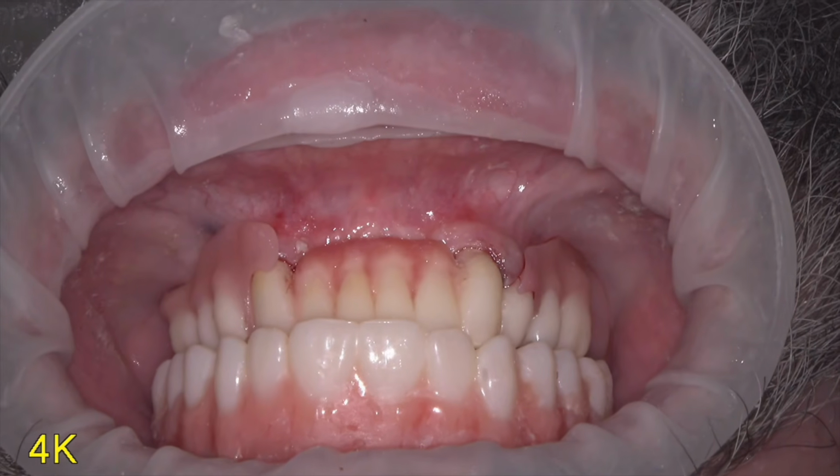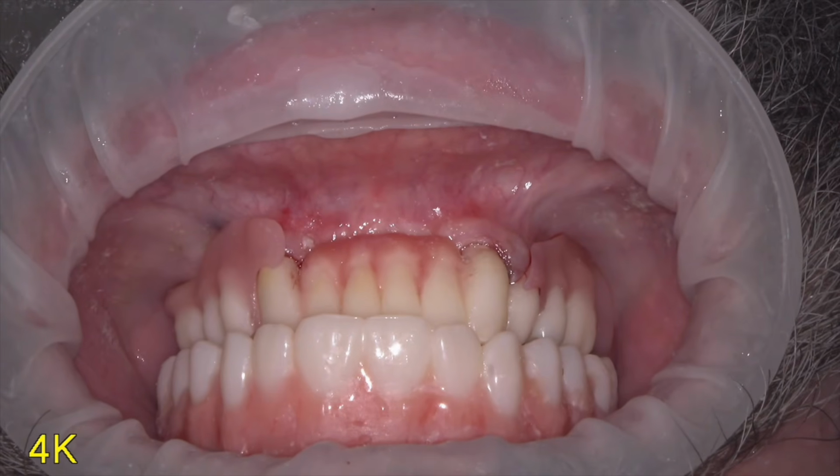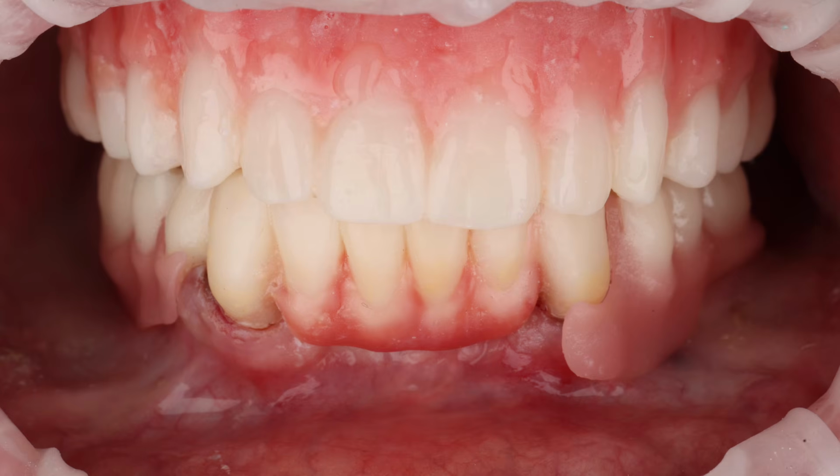And you know, that's what it's all about, doing digital workflows, not having to adjust things. And to think that we did all this in right about 2 hours is pretty cool, considering 1 hour of that was printing. So anyway, guys, I just thought I'd inspire you with a quick little case. Definitely not what I would say Insta-worthy, but just a fast and dirty look at some dentistry that I did.